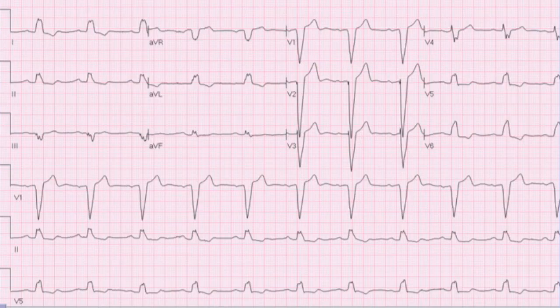You have now learned the five ECG criteria for the diagnosis of left bundle branch block, and should be ready for the ECG on morning rounds. Again, here is the 12-lead ECG. Remind yourself of all five criteria before completing this podcast.